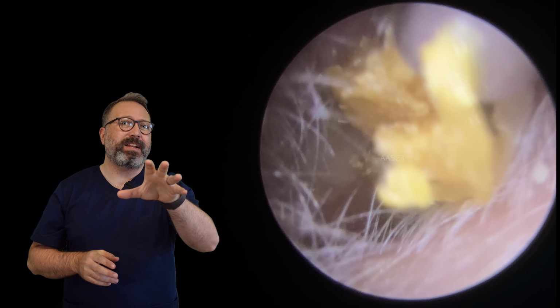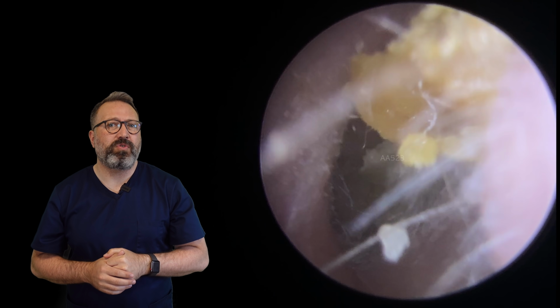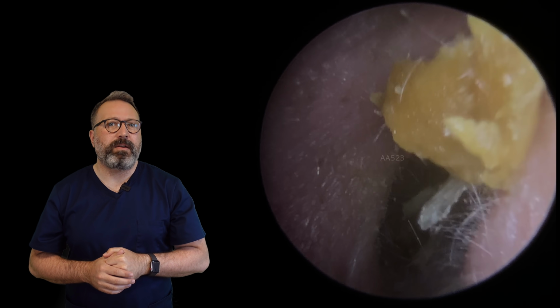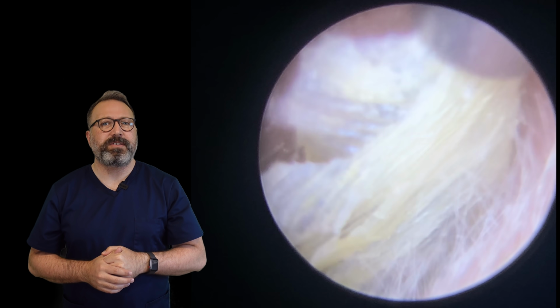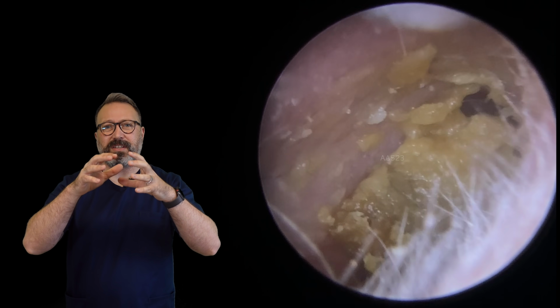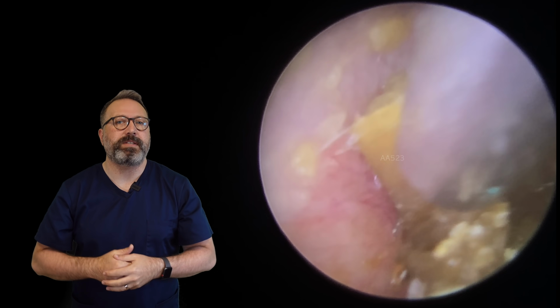You can see that underlying piece of skin and then the wax that's attached to the top of it. So let's draw this out. There we go, out that comes. You'll see that little tail of skin attached to the back end there. It brought another section forward. You can actually see how this concertina is. Now it's a much bigger piece of skin, so we can effectively get on that without it whistling there.